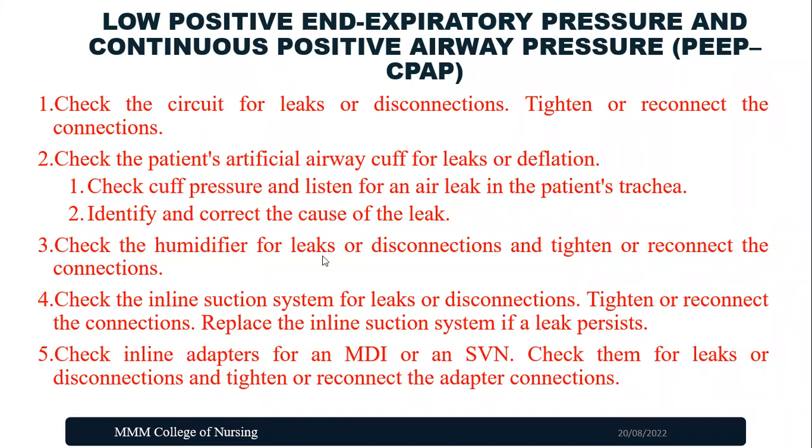Check the humidifier for leak or disconnection, then tighten or reconnect it. Check the inline suction system. Check the inline adapters for metered dose inhaler or small volume nebulizer. Check for the leak or disconnection, then tighten and reconnect it.